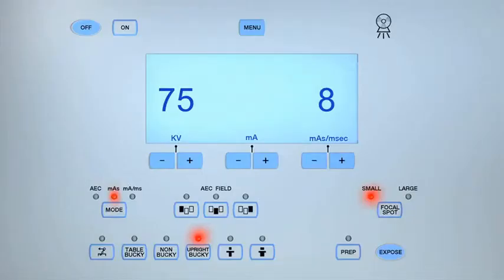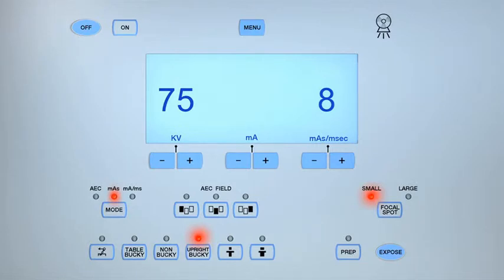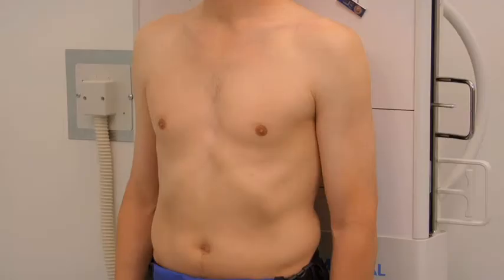Stand behind the protective lead barrier. Check that the exposure technique is appropriate for the patient's body habitus and, if necessary, make any adjustments.